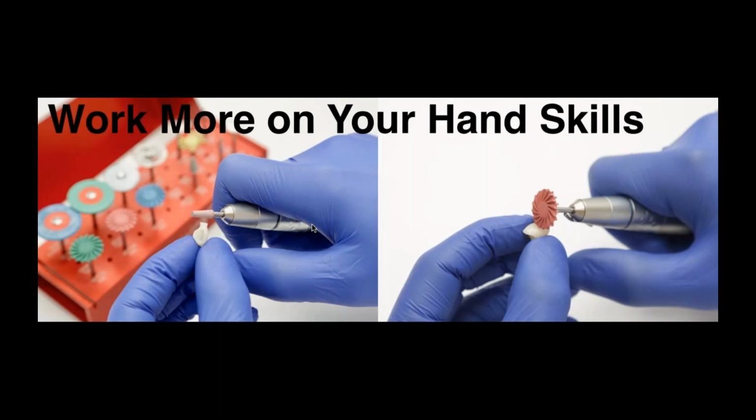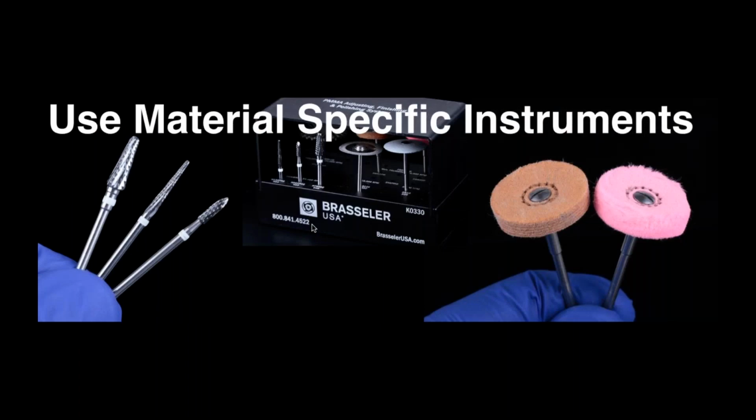No matter how much technology we start using in dentistry, we still work with our hands, so we need to continuously keep challenging ourselves and improving our hand skills. Sometimes I try to mill very thin veneers and try to remove that sprue without touching that margin, or doing the same with zirconia and working zirconia in the pre-sinter situation, which are challenging for me. So always try to keep getting that training on your hand skills, which is fundamental for the clinical success.